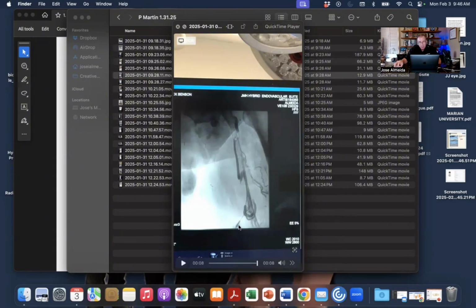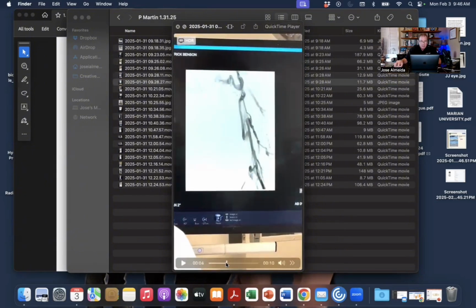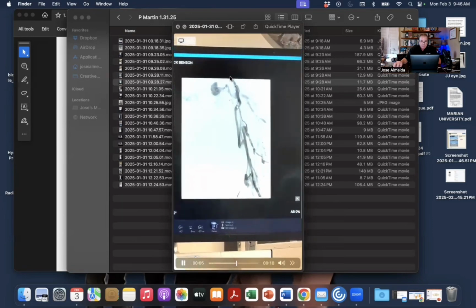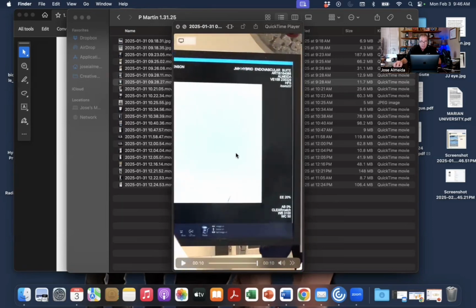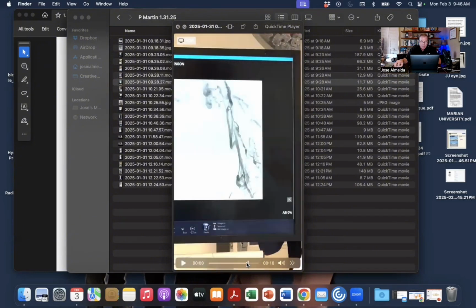So I thought going from below might be better at the posterior tibial vein at this point. There's our venogram, a lot of collaterals, the stent occluded. These are collaterals around the stent, an occlusion of the femoral vein with the collateral going around it. You can see that occlusion of the femoral vein with a collateral going around it. All right, the femoral vein down here, the lower thigh, is open.